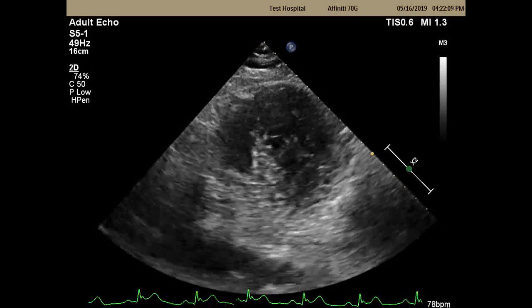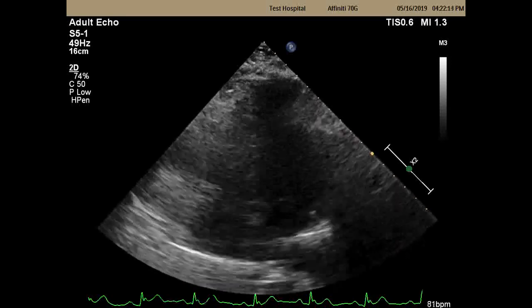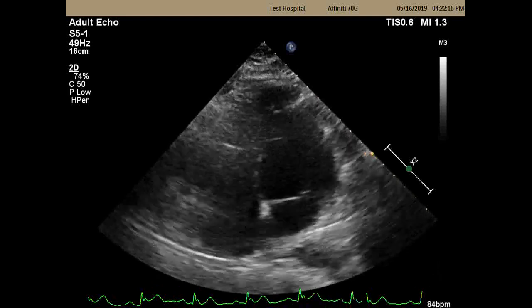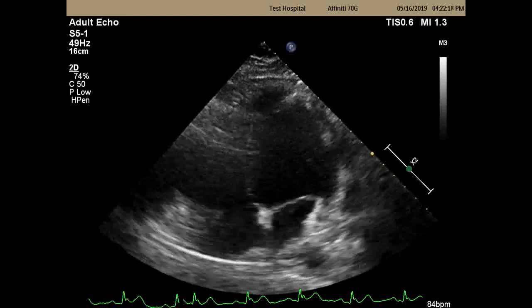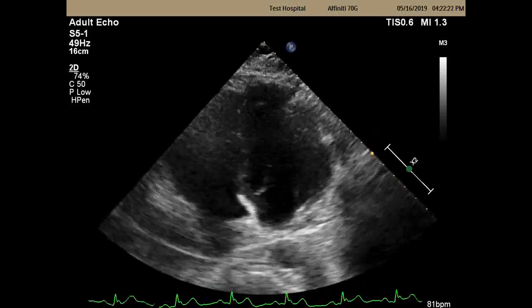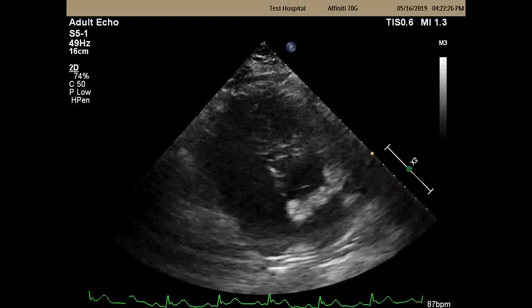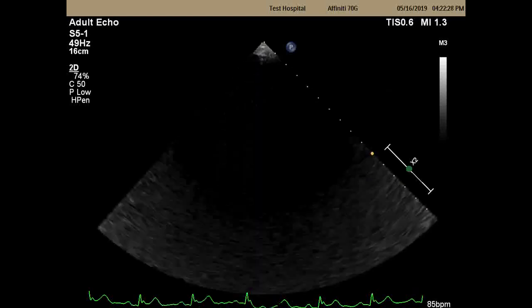So one of the keys here is that we want to maximize the chamber, the endocardial border definition, and it doesn't matter if things are centered. Ashley mentioned how Doppler strain is really angle dependent. So if I had an angle like this for a Doppler-based modality, it would be unacceptable, right? I'm gonna roll a little more, Nick.